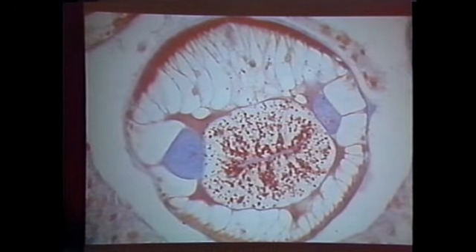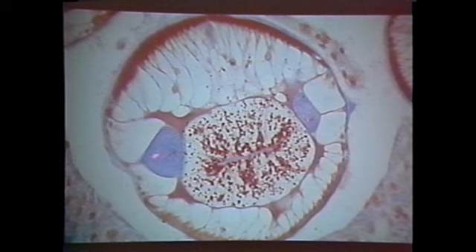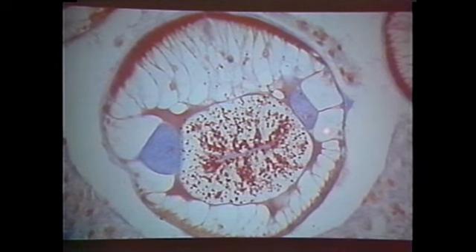Sometimes lateral cords as well will have associated structures in them. Look at these kind of gland cells. But how can you tell lateral cords from muscle? Well, it's red and white, and then all of a sudden it's all white, and it's got red and white. And then there's little alae here as well. Okay, lateral alae.